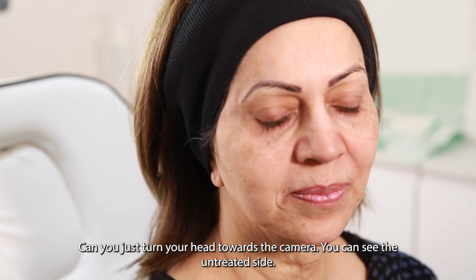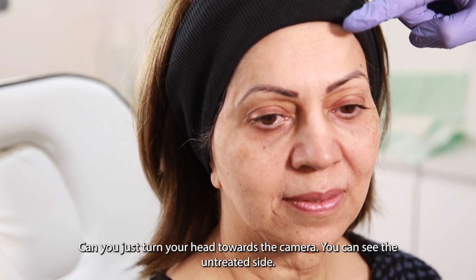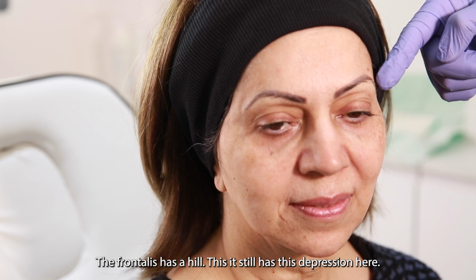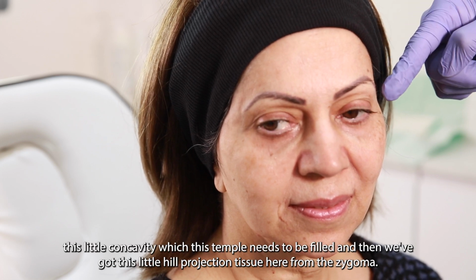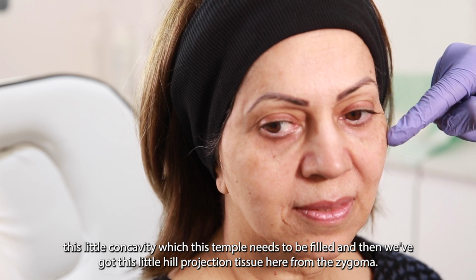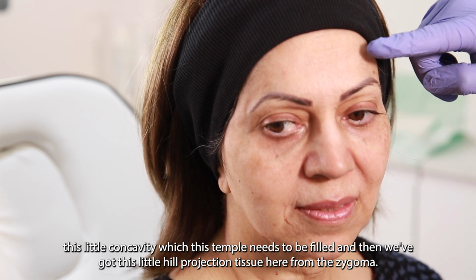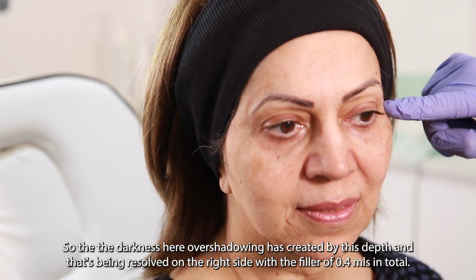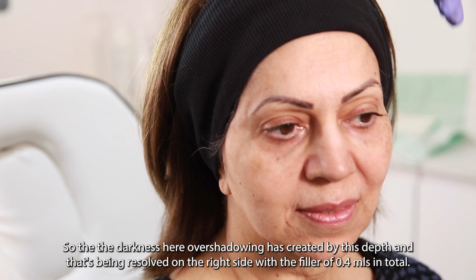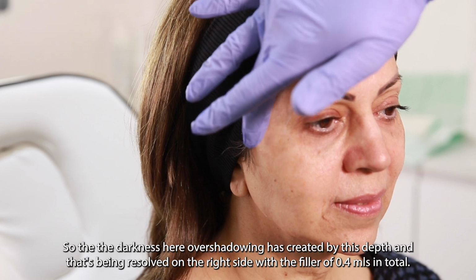If you just turn your head towards the camera, you can see on the untreated side, the frontalis has a hill, then it still has this depression here, this little concavity, which this temple needs to be filled. And then we've got this little hill projection tissue here from the zygoma. So the darkness here, or the shadowing here, is created by this dip. And that's been resolved on the right side with the filler of 0.4 mils in total.